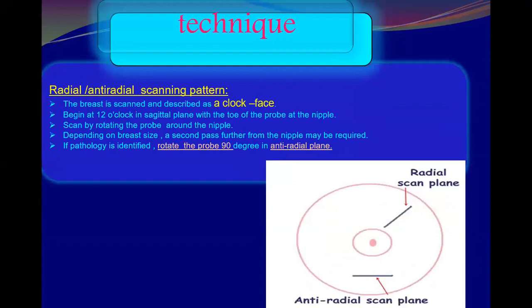The other technique is the radial and anti-radial technique. It is the same as the clock face technique. In radial and anti-radial, generally we start at the 12 o'clock position in a sagittal plane with the toe of the probe at the nipple.